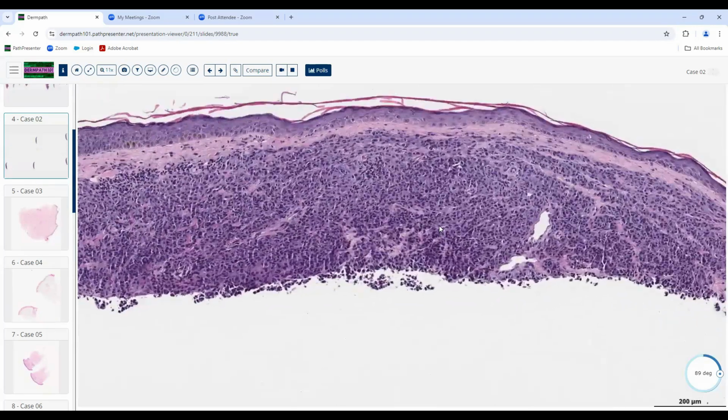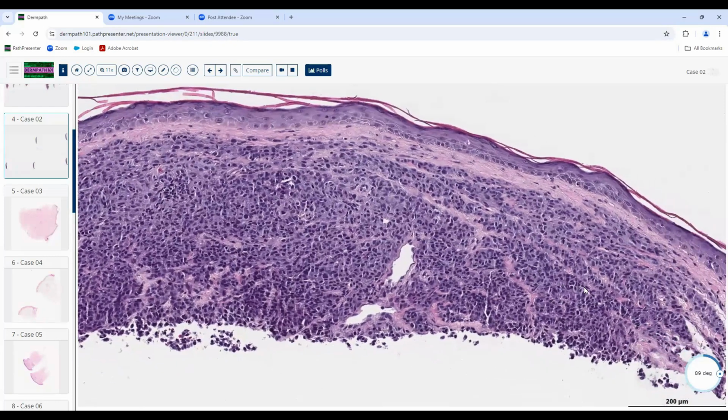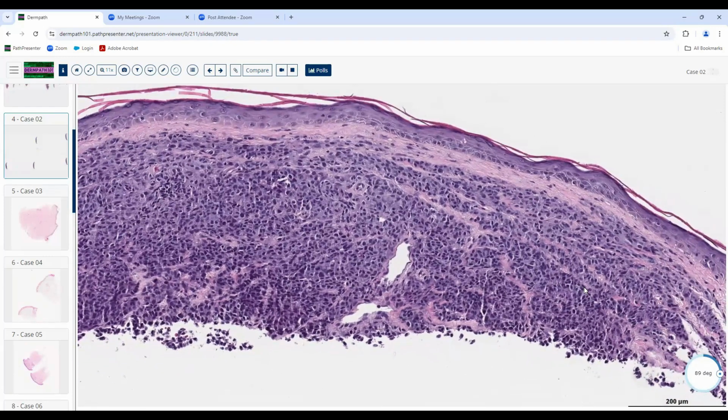We go to higher magnification, and we always talk about doing everything at low, and then you want to refine the diagnosis when you go to higher magnification. It's not like we're just going to always make a conclusion at low magnification. Sometimes we will if we see an obvious basal cell or molluscum or something like that. Sebaceous, we just may not even go to higher magnification. But in something like this, we would always go to higher magnification.